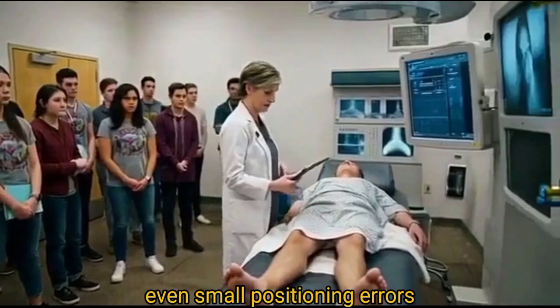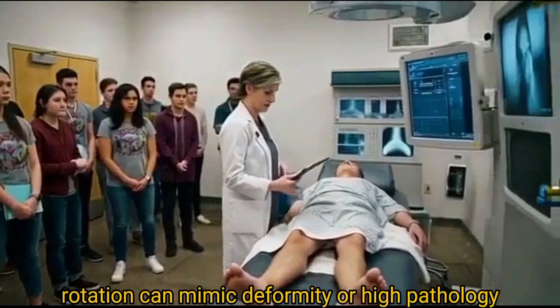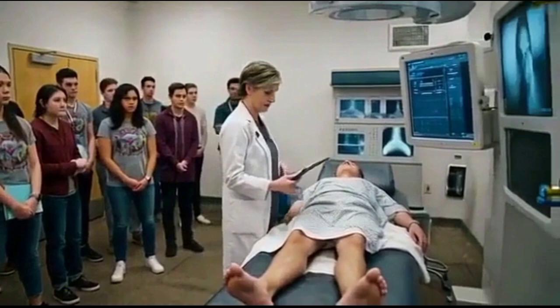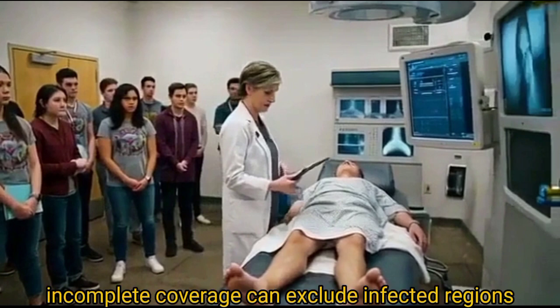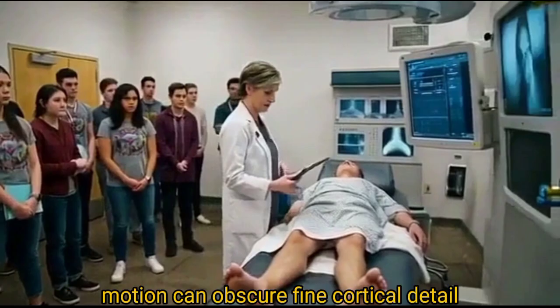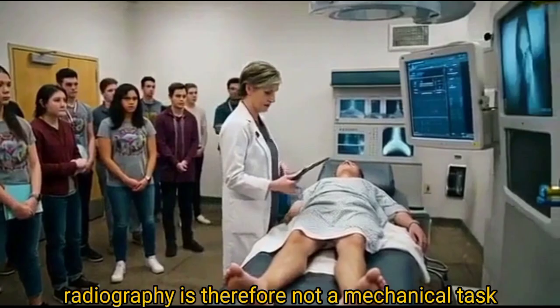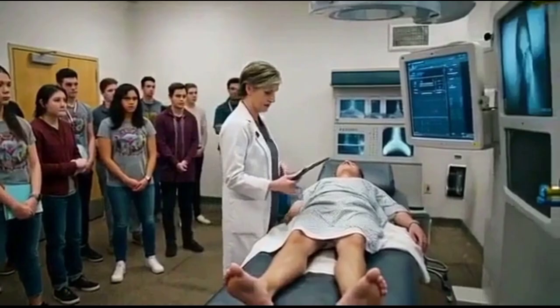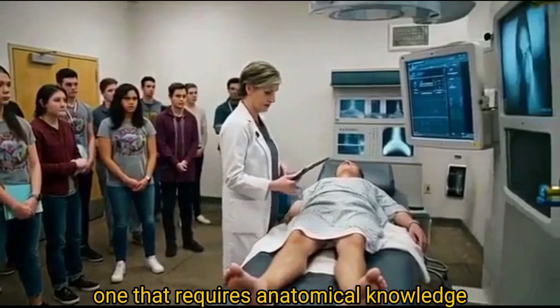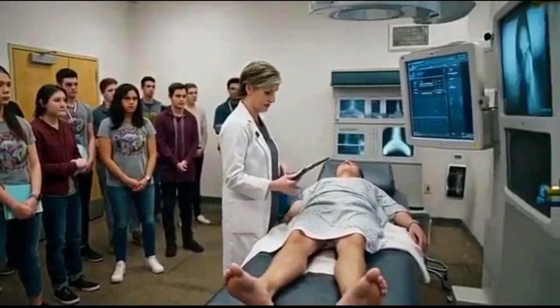Even small positioning errors can significantly alter diagnostic accuracy. Rotation can mimic deformity or pathology. Incomplete coverage can exclude infected regions. Motion can obscure fine cortical detail. And underexposure can mask early bone destruction. Radiography is therefore not a mechanical task. It is a clinical responsibility, one that requires anatomical knowledge, technical precision, and constant diagnostic awareness.